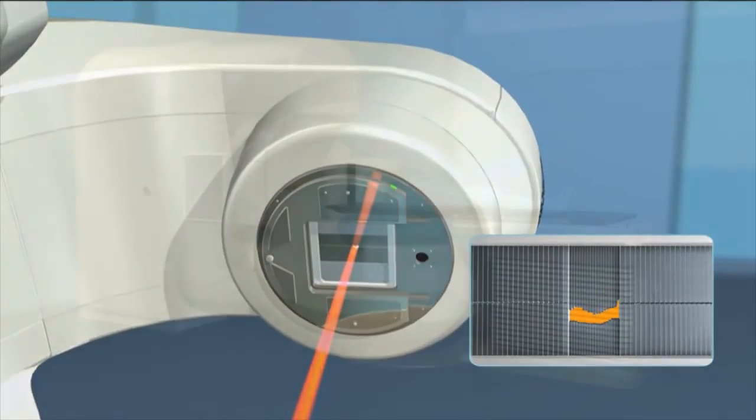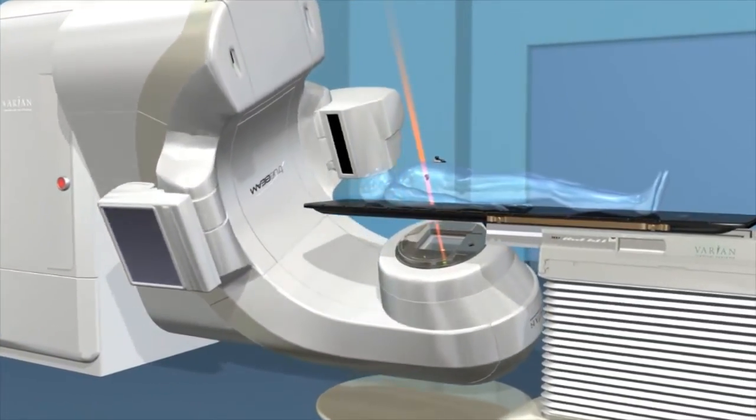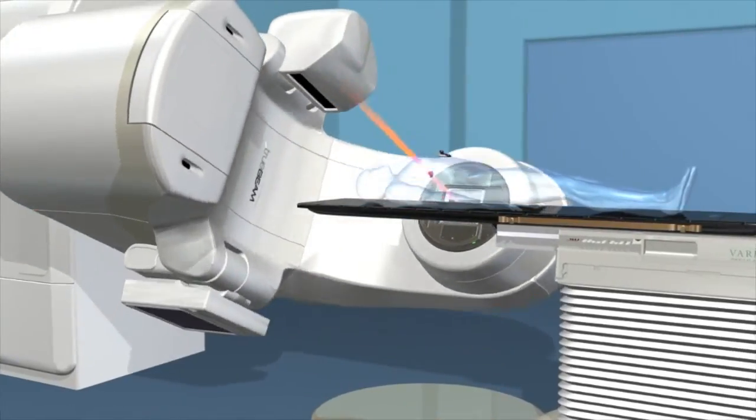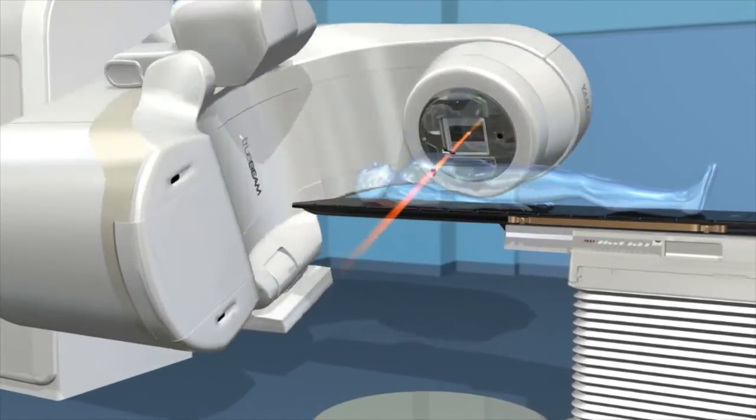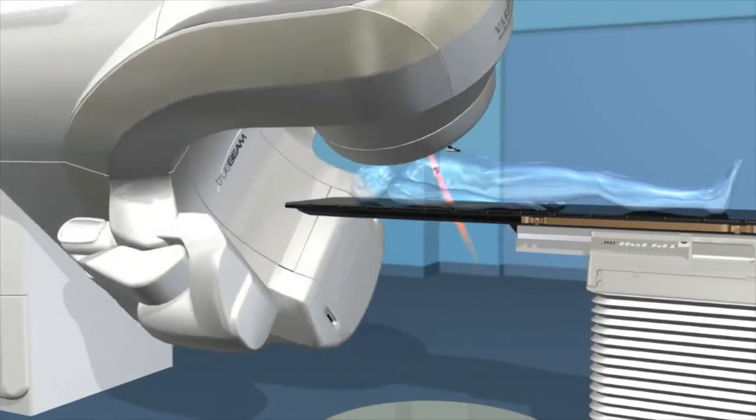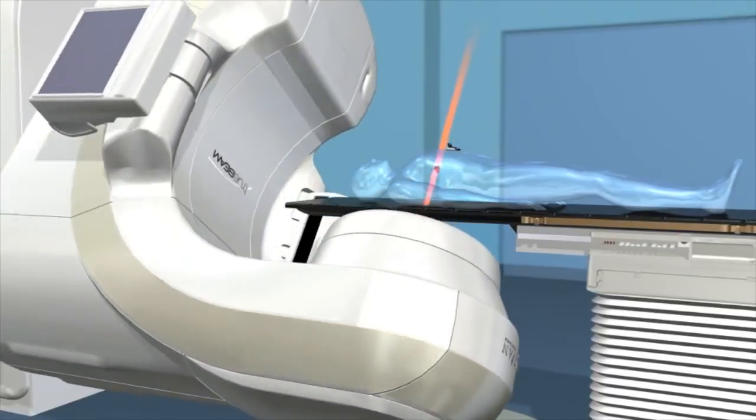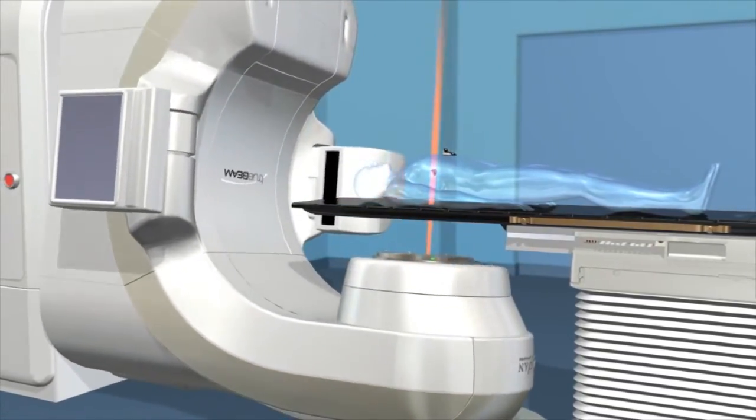During the delivery process, the gantry will revolve around you, delivering the radiation with submillimeter accuracy. The beams are actually invisible and are shown here for visualization purposes only. You may also hear the machine as it rotates. Most people feel nothing from the treatment itself.